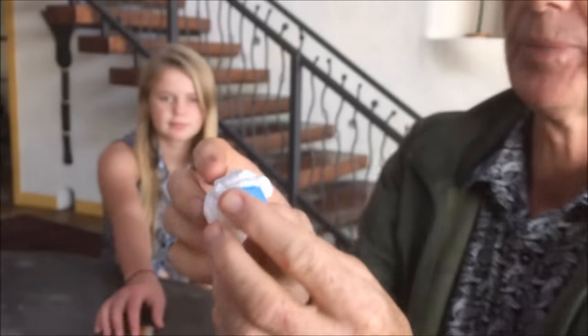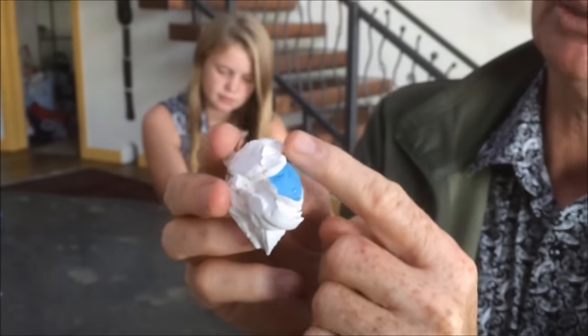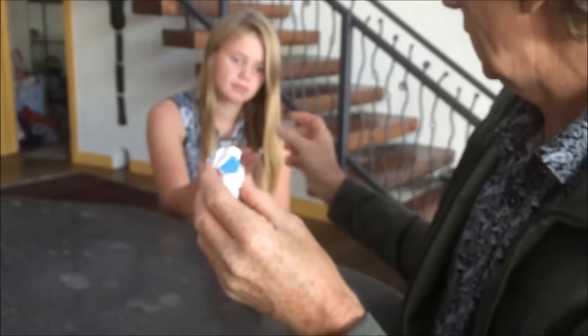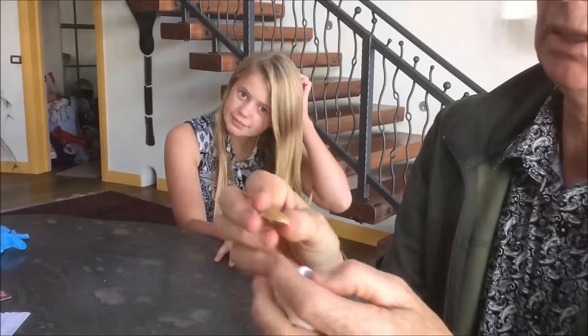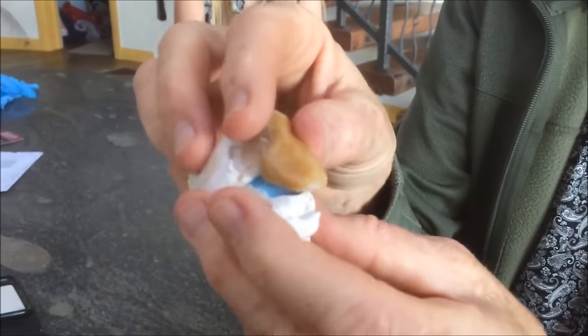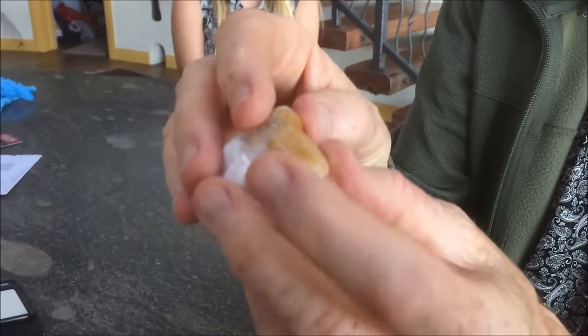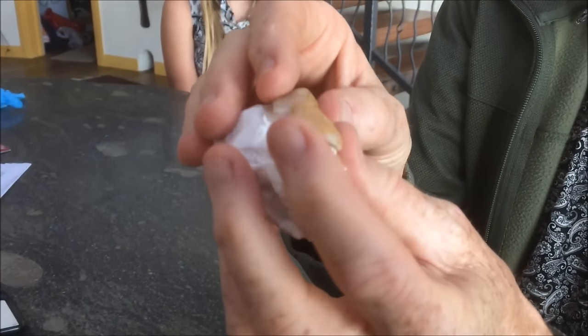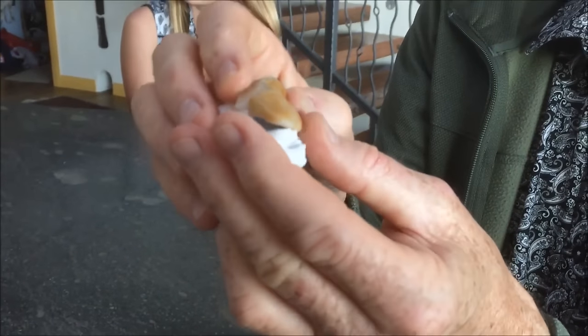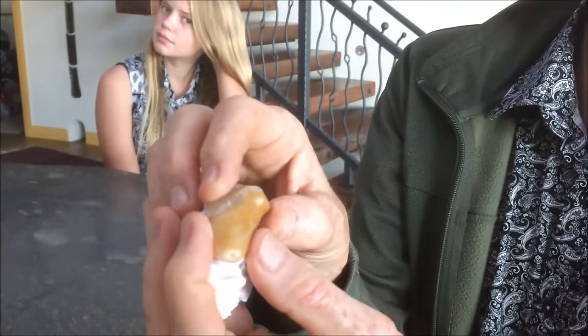After that I was able to add composite resin and some stuff called triad gel on top of that. Kayla's got the beak — here it is, ready to go. It will fit on there, but the triad gel makes it a little bit tight. Anyway, that is the beak and we're going to cement it onto Nibbles' damaged beak in a minute.